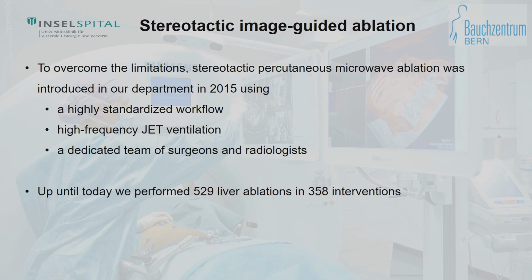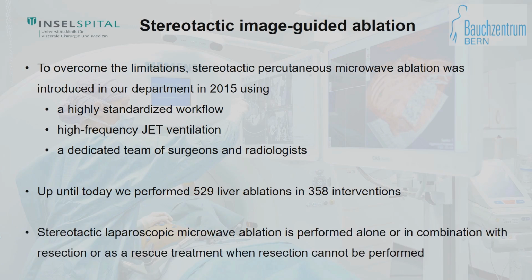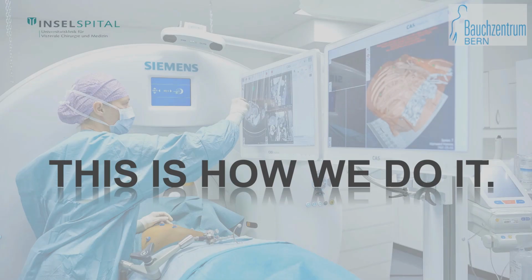Up until today, we performed 529 liver ablations in 358 interventions. Stereotactic laparoscopic microwave ablation is performed alone or in combination with resection or as a rescue treatment when resection cannot be performed. And this is how we do it.